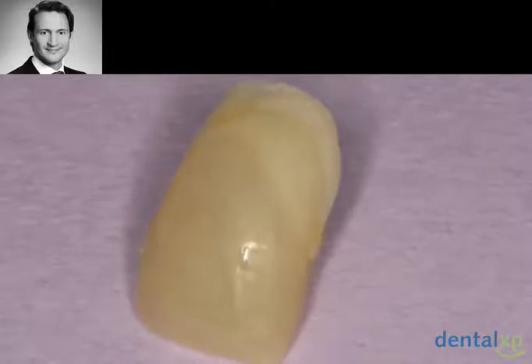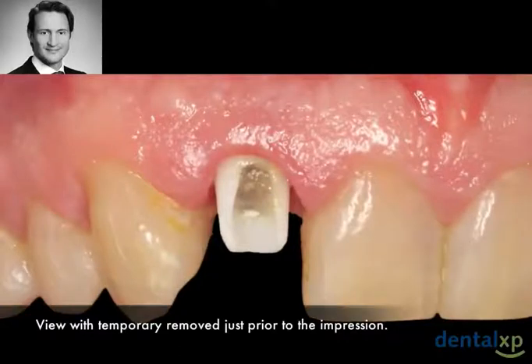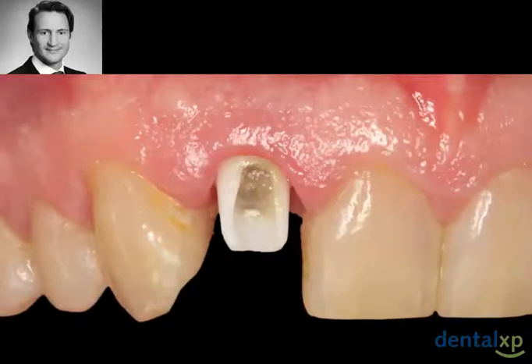And in this case, I utilized ProTemp and composite at the margins of the temporary. Here's a clinical photo of the site just prior to impressions. The temporary has been removed and the Fermit is still in place.